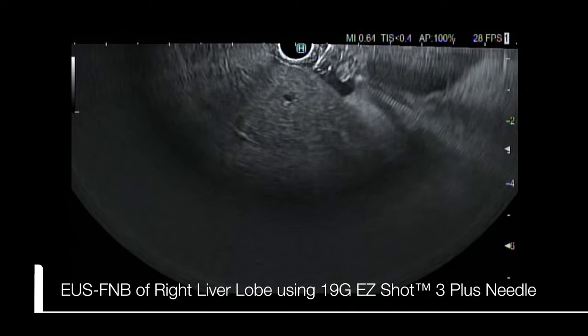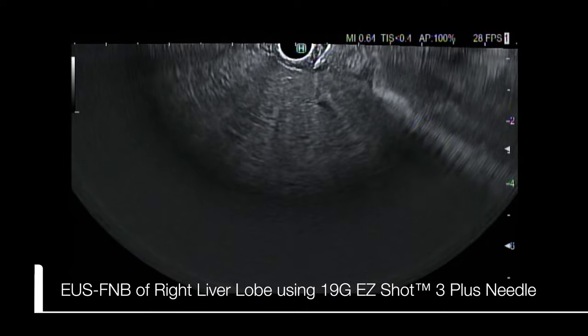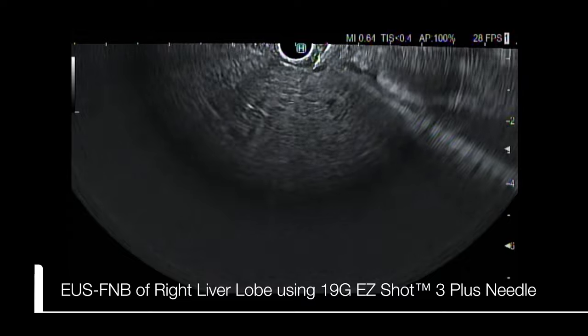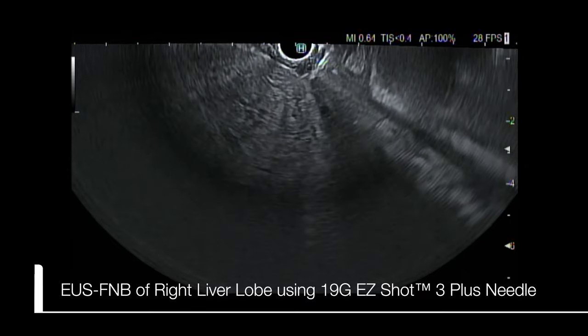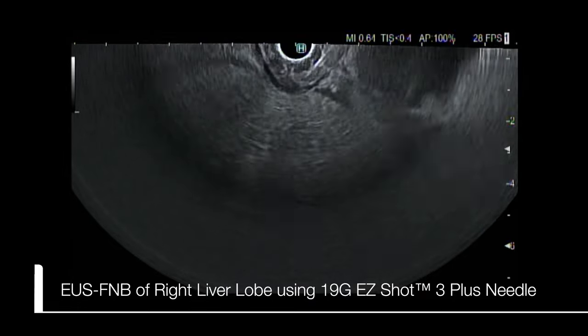The tip of the 19 gauge EasyShot FNB needle is then advanced to the duodenal wall, and under endosonographic vision the needle is punctured into the right lobe of the liver.